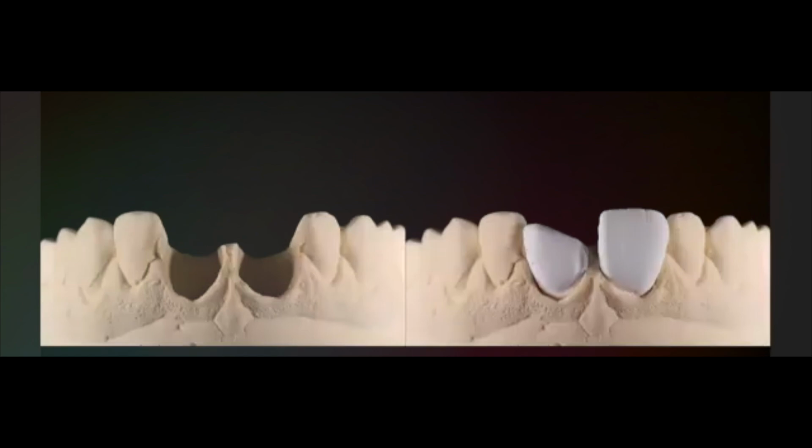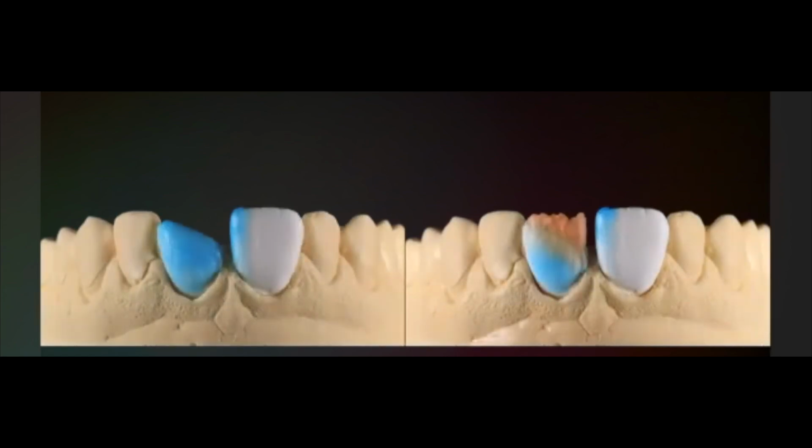So refractories, dyes, and then the first thing that we had to do was to correct the missing part of the 21 central. So we used pure transparent for foundation, and then I used opacious body to extend and to apply opacity, the missing opacity, and then secondary opacious body.